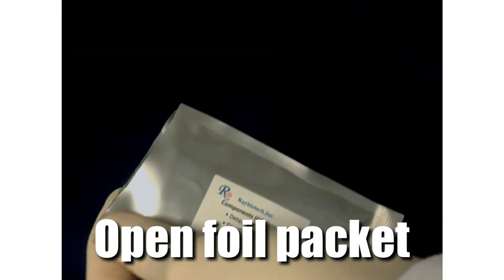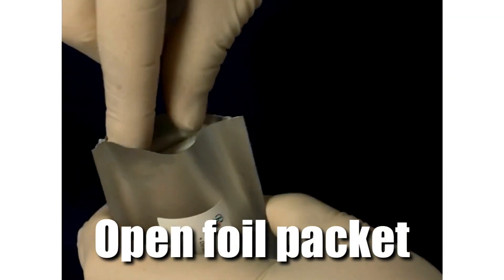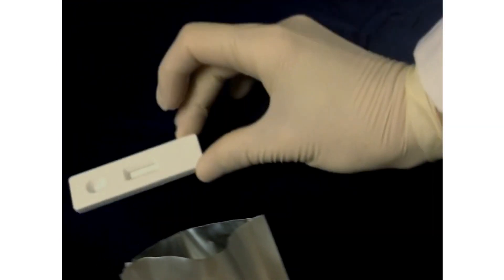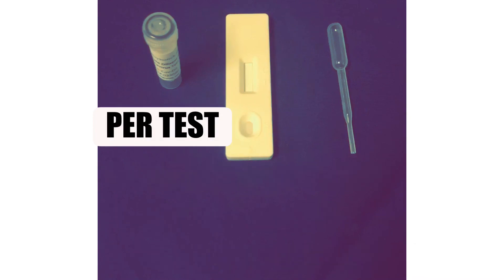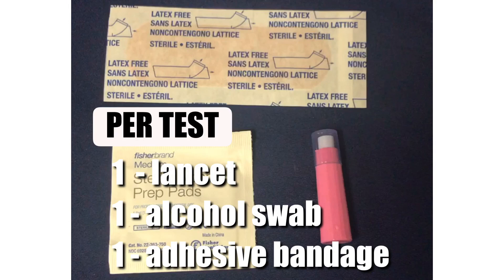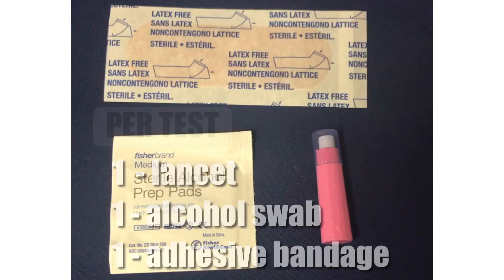To perform a test, first open a foil packet containing the detection cassette. Set aside one detection cassette, one plastic pipette, and one vial of sample diluent. For finger pricks, you will also need one lancet, one alcohol swab, and one adhesive bandage.